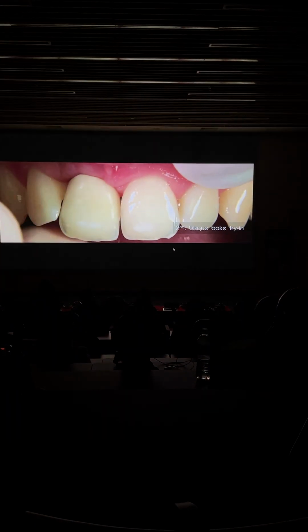And then being myself a dental technician, I tell him, listen, you don't have too much chroma, I want more pressure, the contact point is concave, I want you to push a little bit more on the buccal aspect. I need more contact points proximally. I want more of the surface. I need to push more proximally and buccally. So he makes a second bake. He tries to make all the indications.